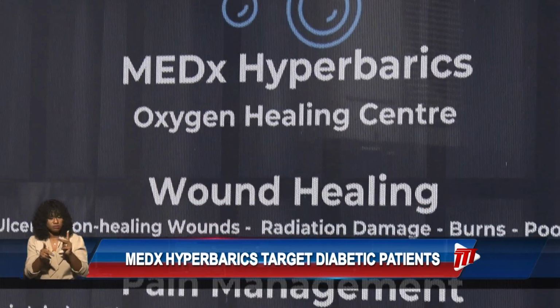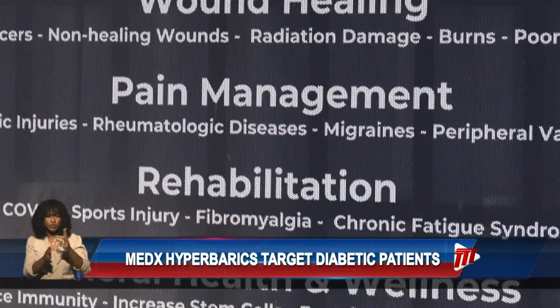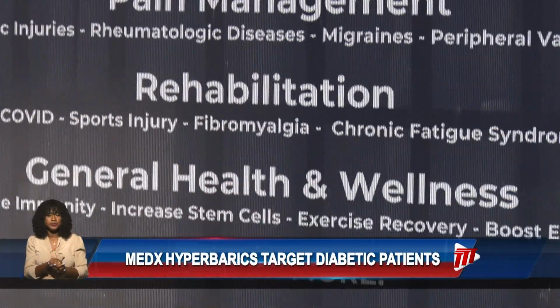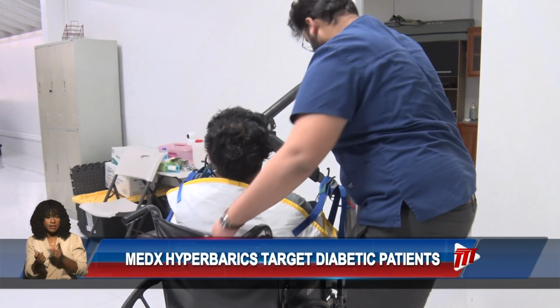We have invested in multiple of these soft chambers, medium-pressure chambers, as opposed to investing in one hard chamber. And the reason for that is that it can, of course, treat more patients. Each treatment lasts at least an hour and a half. So that's going to limit how many treatments you can do per day. Dr. Rahman said these chambers are constantly reviewed globally for its wide-ranging use and will only gain popularity. And he said it is beginning to become noticed locally by both doctors and patients who need it.